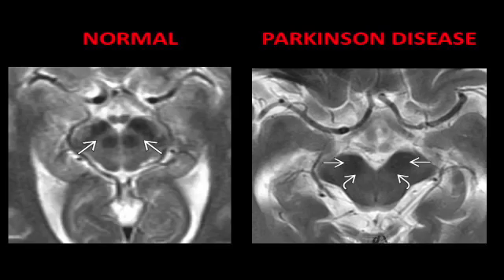Another type of abnormality that can be detected earlier on involving MRI would be Parkinson's disease. And it's with this image right here that is how the MRI will appear if the client is showing signs earlier on of Parkinson's disease. So that's another cool feature of this diagnostic test.